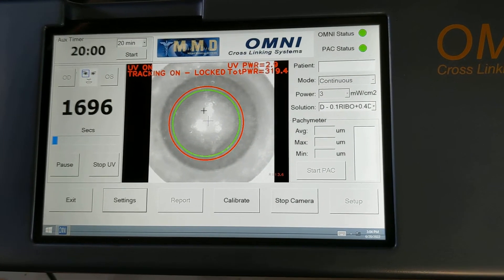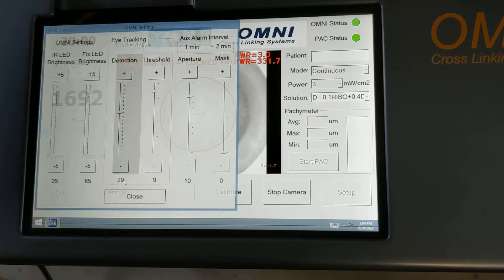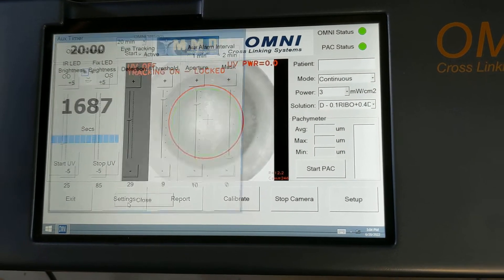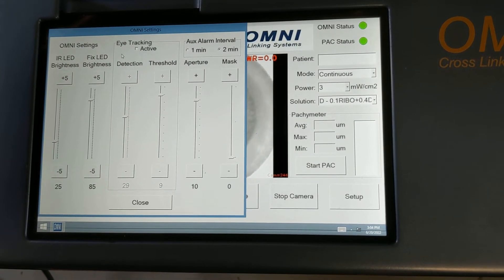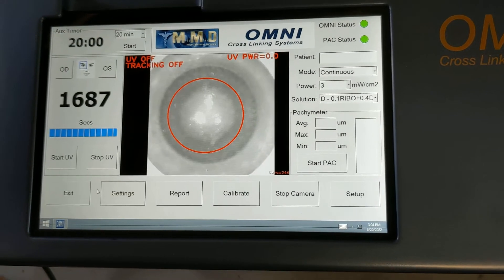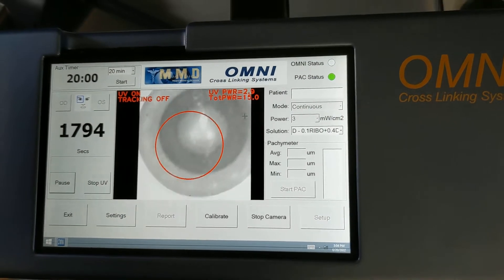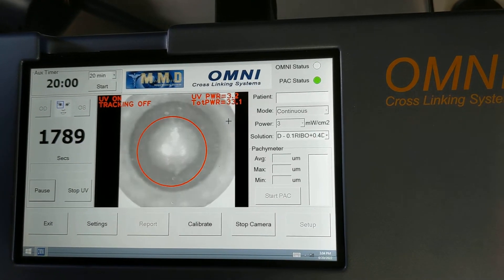If you don't care about tracking, you can stop the test, go into settings, and uncheck the 'Eye Tracking Active' checkbox, then start the test again. The UV power is going to be on regardless of where the eye is looking — it's not going to go off.